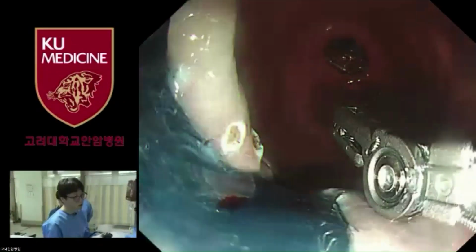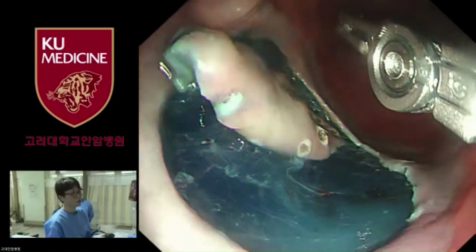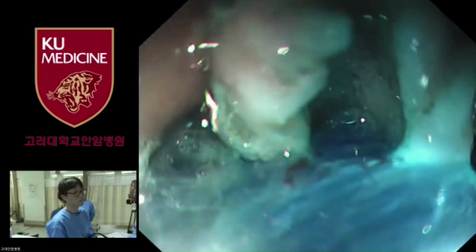And then if there is a bleeding underneath the lesion, maybe we are very good at using the transparent cap, and then penetrate into the submucosal space, find the vessel and coagulate it. But sometimes it's not that easy.